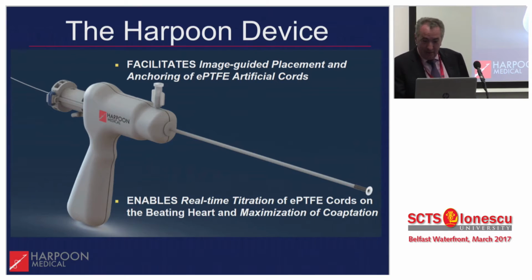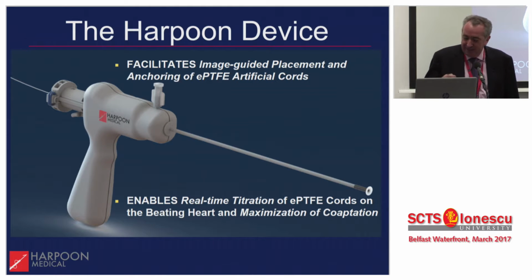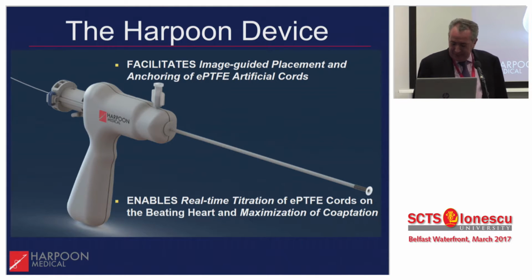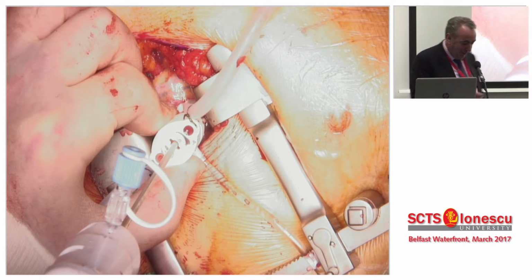Yeah, sure. Okay, so this is a device that we've been involved with recently. I think we've done about 8 of these procedures now. A little bit more sophisticated device called the Harpoon. Very interesting technology. The Gore-Tex is wrapped in a specific way on the needle, so that when you push it through the needle, the Gore-Tex comes off and ties itself in a preformed knot.